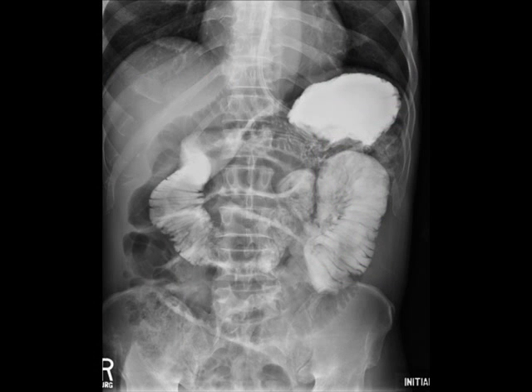Once all of the contrast has been ingested, the technologist will note the time and take the first or initial image. This image is centered higher to ensure that the stomach is shown in its entirety. Initials should be placed on the image either with a lead marker or with computer annotation.